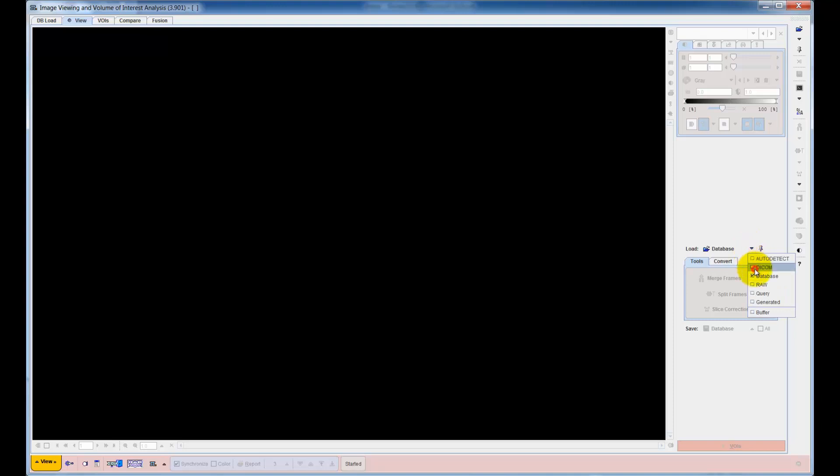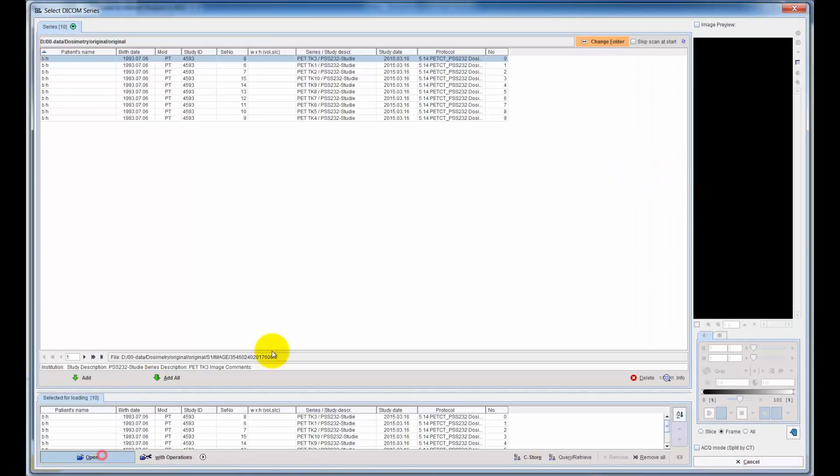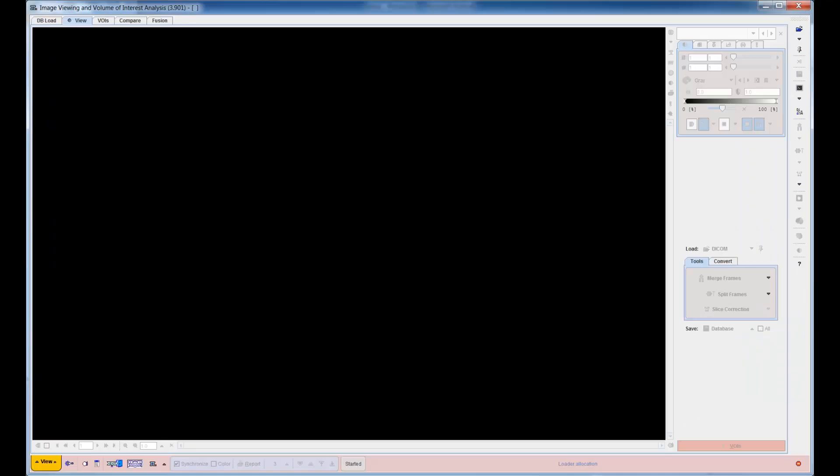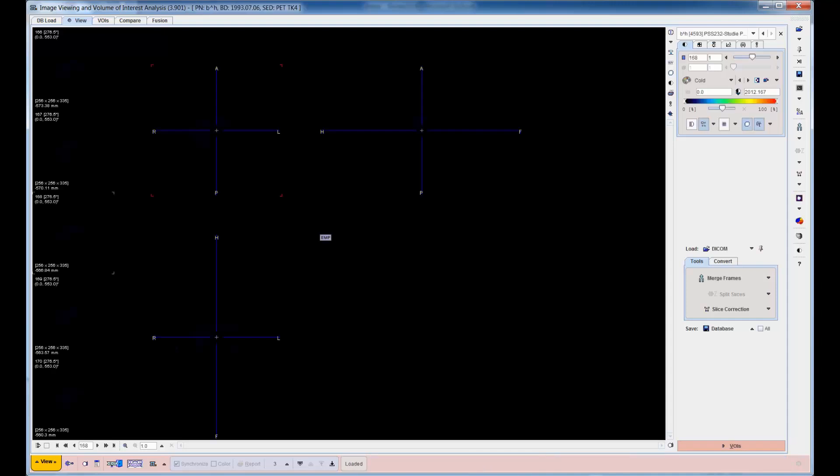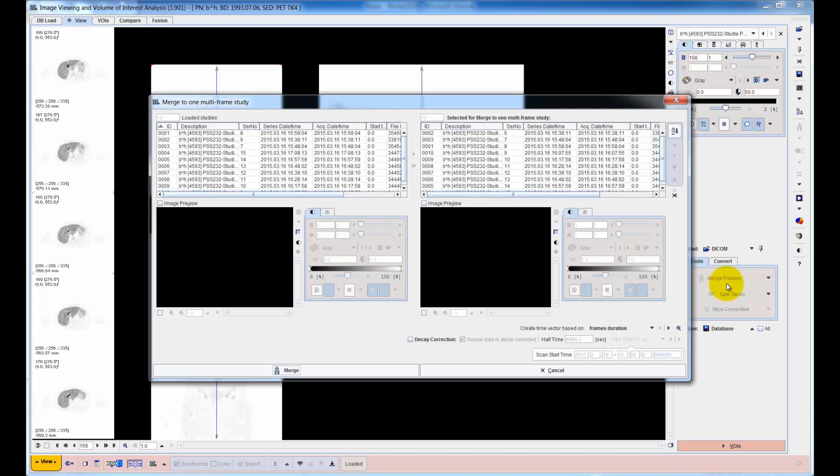The 10 sequentially acquired static series are loaded into the view tool. The merging tool for combining them into a dynamic series is opened.